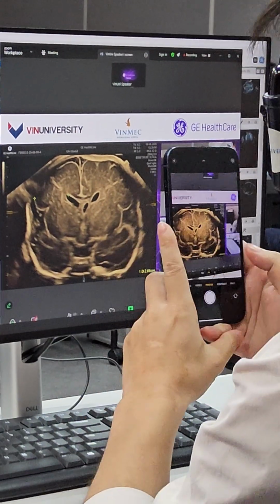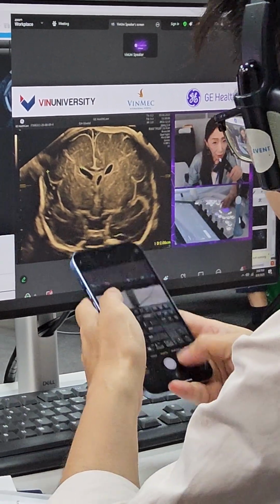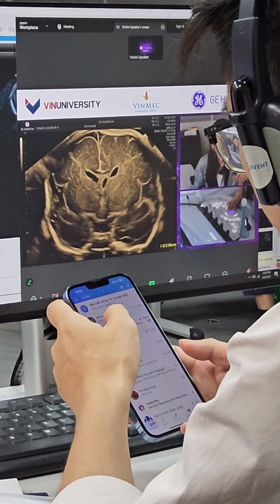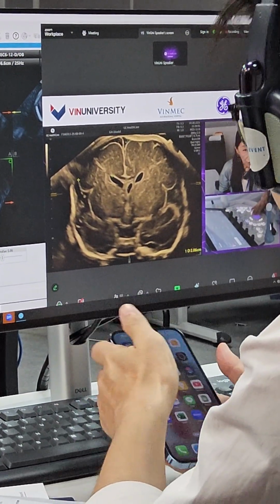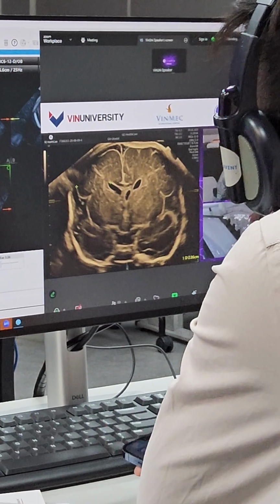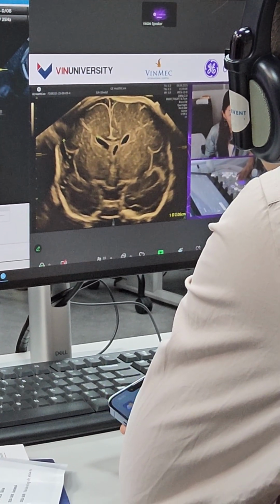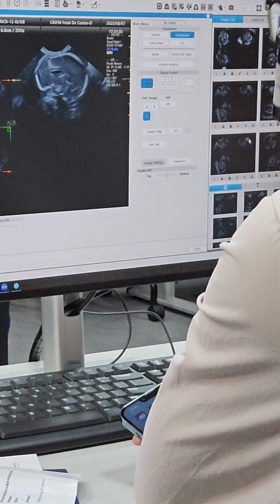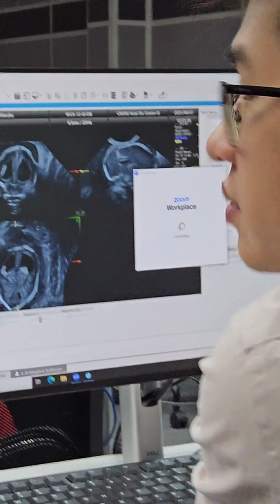So this is just one measurement, but most probably if you measure the volume, the difference is much more. Okay, because volume is centimeter multiplied by centimeter multiplied by centimeter. So that is much more. So this is completely, you know, the normal.